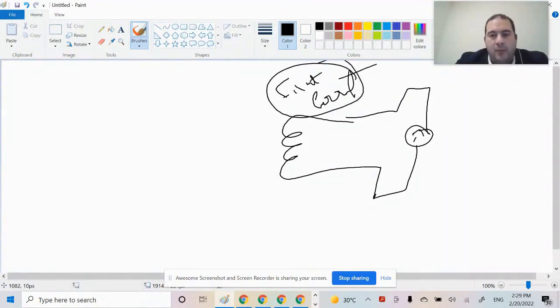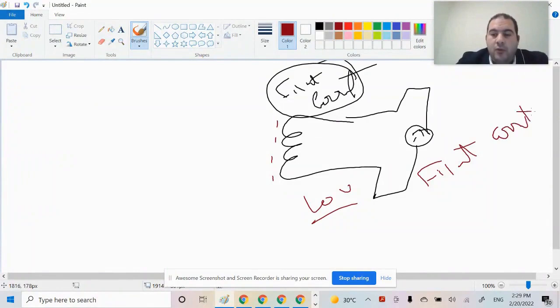The filament current represents how much I increase it. The more I increase it, the more electrons are liberated at the surface in large quantities. Now the filament needs a voltage to operate, and this voltage is relatively small, reaching about 10 volts. In order for these electrons to move and gain kinetic energy, they travel through the wire of the filament itself. So I have filament current and filament voltage. Let's pay attention to these: filament current and filament voltage.